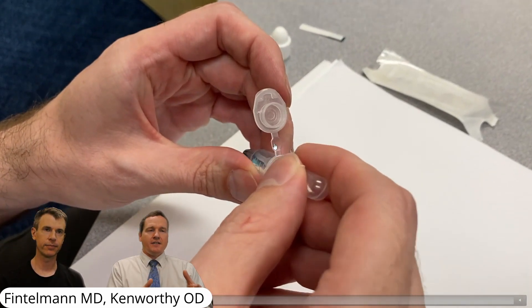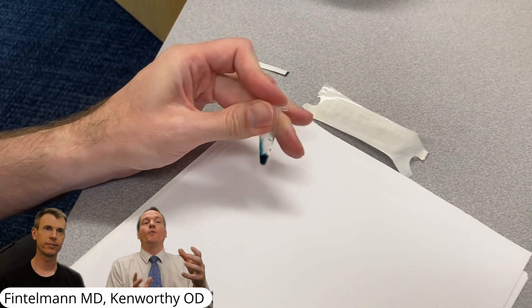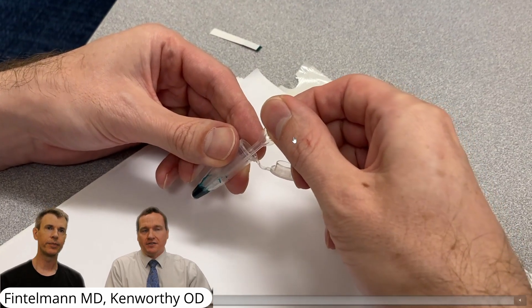Lissamine green can be used for a lot of things on the ocular surface. We're looking at things where the conjunctiva might be a little damaged, the cornea might be damaged, and it stains defective or dysplastic type cells on the ocular surface.